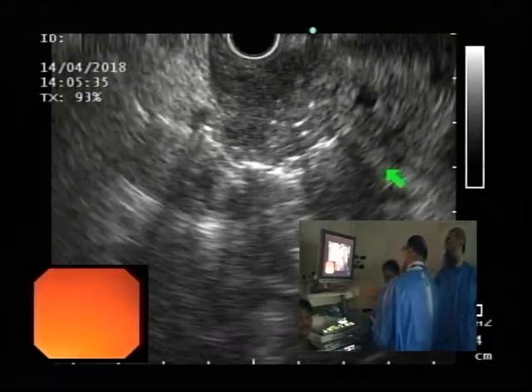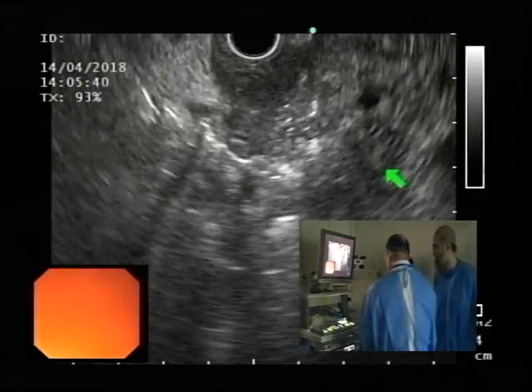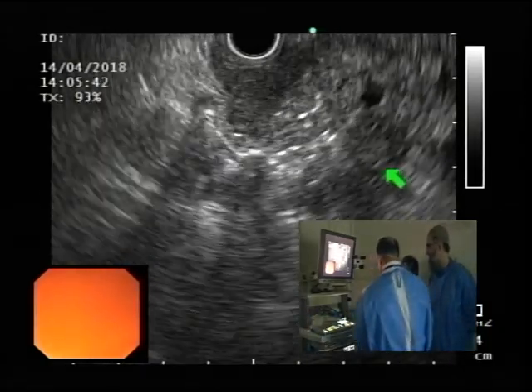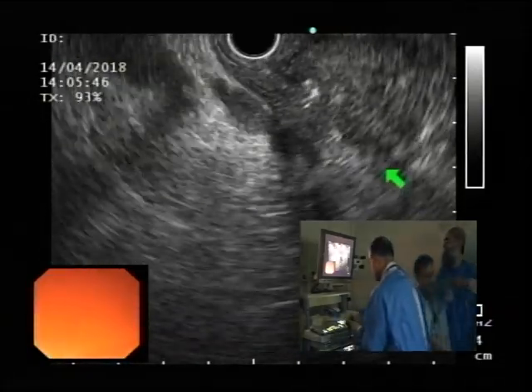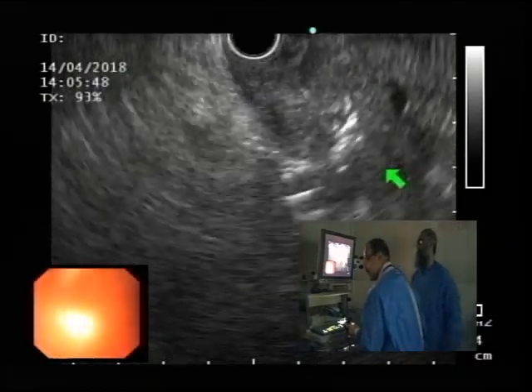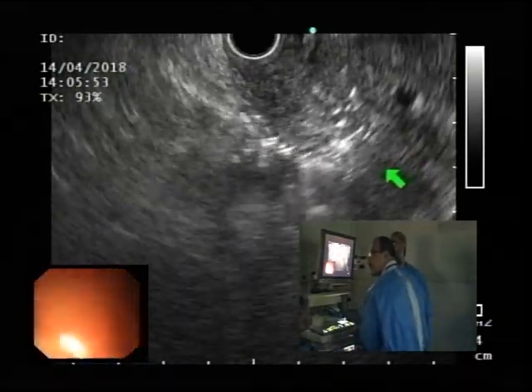No urgency. अच्छा, what I want you to do is I want you to get a sense for this. I'm going to get you to second portion, and I want you to just. Oh sorry, cap दे दें यार. वो लगा दी, sorry. I think we're still in second portion.